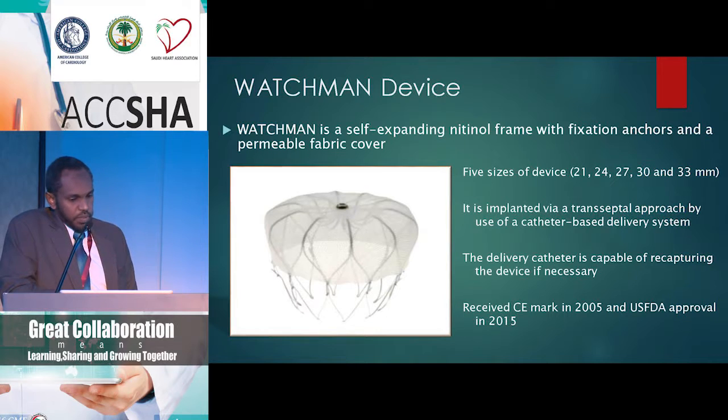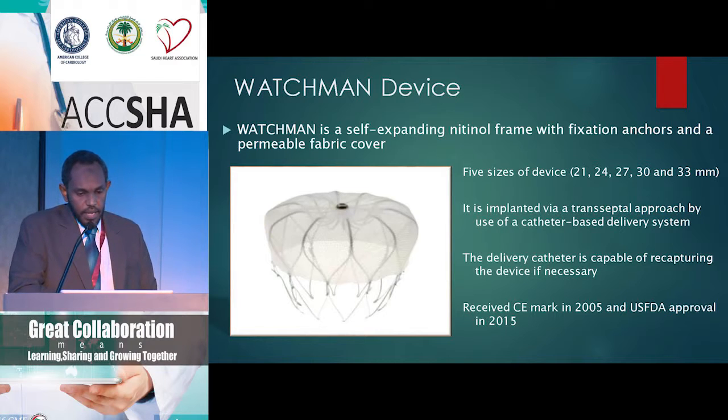A little bit about the WATCHMAN. Basically, it's a self-expanding nitinol frame with fixation anchors and a permeable fabric cover. There's 5 sizes available, 21 to 33, and it's usually implanted by transseptal approach using a catheter-based delivery system. Of course, it allows for retraction and recapturing the device before we deploy it eventually and finally when we're happy with the position. It received its CE mark in 2005 and US FDA approval in 2015.